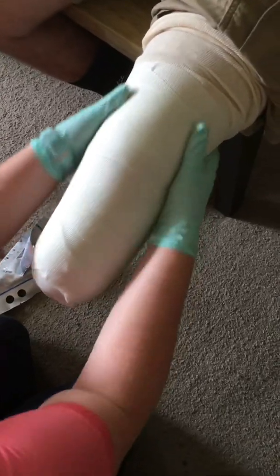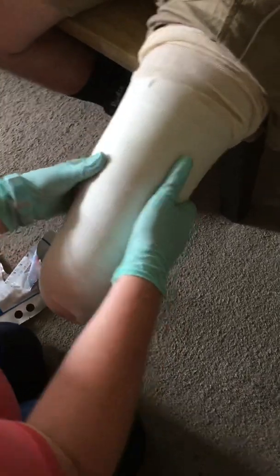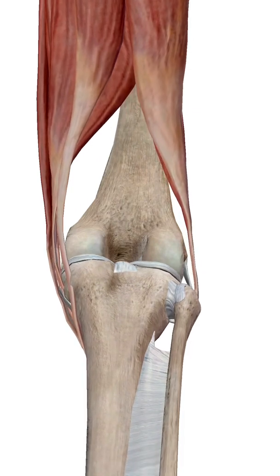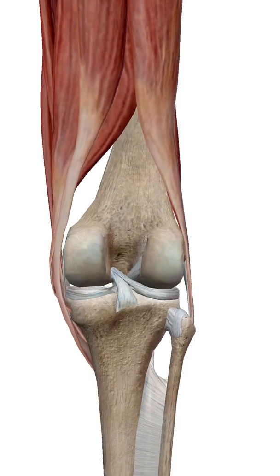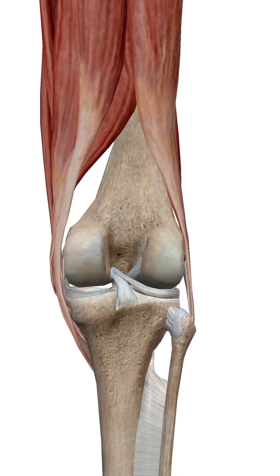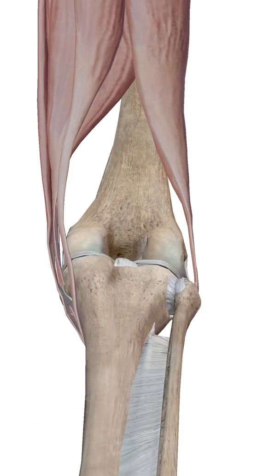As you're molding these areas you want to pay attention to what your material is doing. When you notice that it's starting to harden but still has some workability left in it, you need to ask your patient to flex their knee as much as they can so you can set the posterior trim line of your socket. The reason we do this is because those hamstring tendons we mentioned at the beginning move when a patient flexes their knee — they kind of drift in and up — so we have the patient fully flex their knee so you can account for that in your cast. That way you're not getting any areas that impinge and make the patient uncomfortable when they're fully flexing their knee inside their socket.